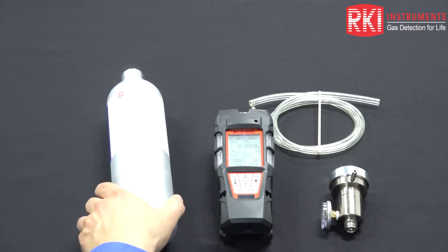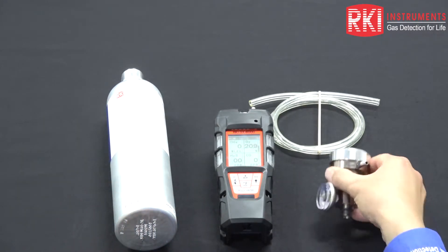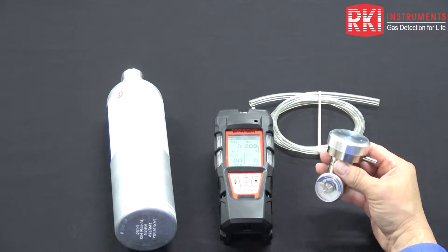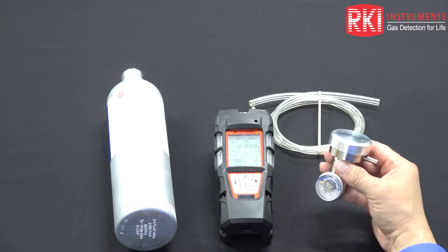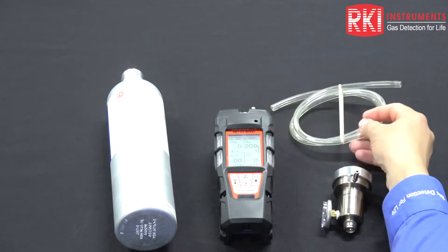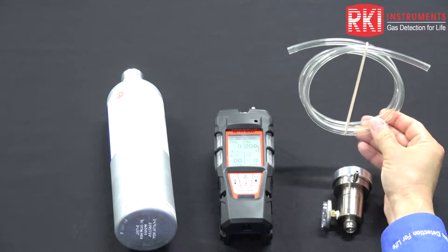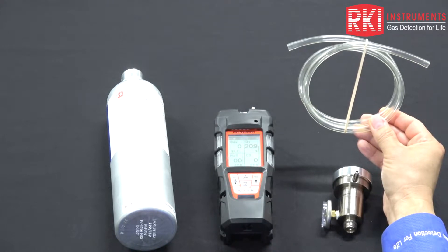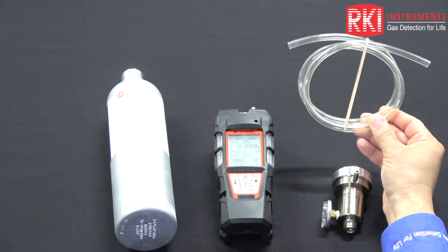The regulator we're going to be using is a demand flow regulator. This particular regulator uses the vacuum action of the pump to draw the gas directly from the cylinder and into the unit. Finally, we have a small piece of calibration tubing consisting of polyurethane, approximately 3/16 inch by 5/16 inch.